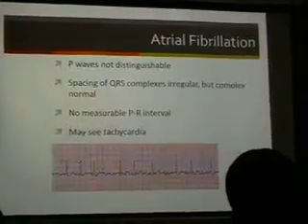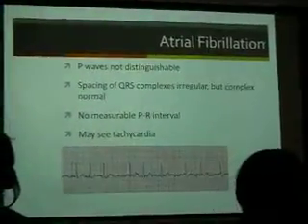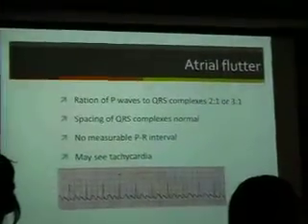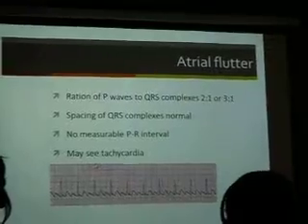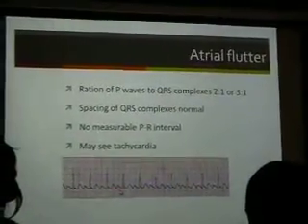The atrial flutter looks like it's right? If you want to take a look. But then there is a picture where it has multiple P waves. Multiple P's? Yeah, and so it could be that atrial flutter, depending on how fast your P waves are, will come across as more or less.